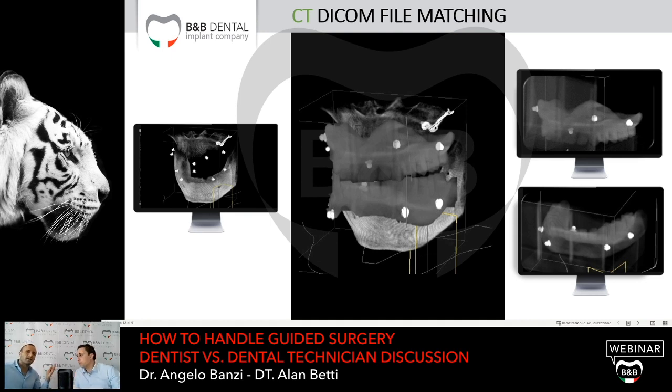So the question is, how do I know where and how the shape of the soft tissues is? Well, Alan answered us, because he revealed that the soft tissues come from the inner face of the radiological template.